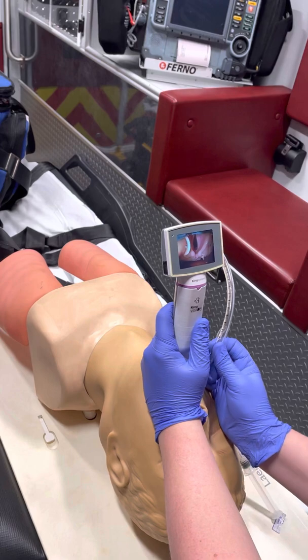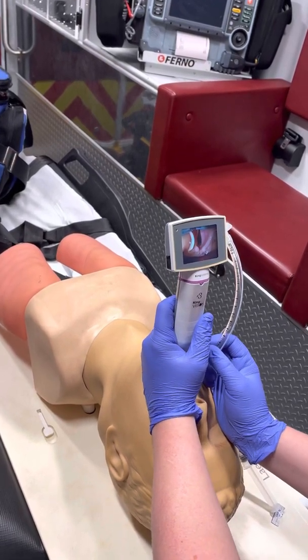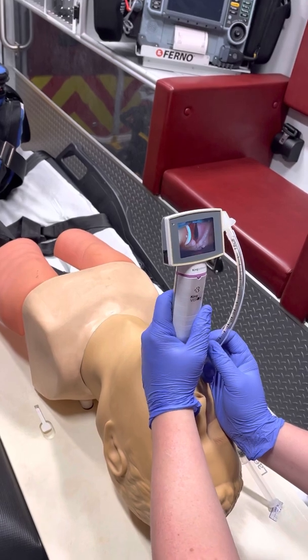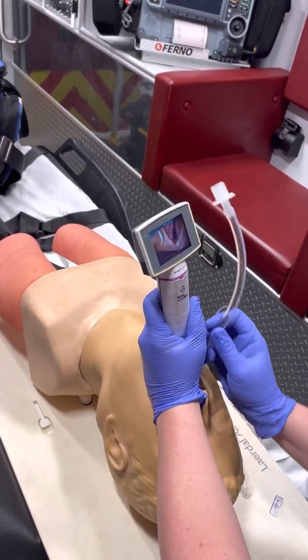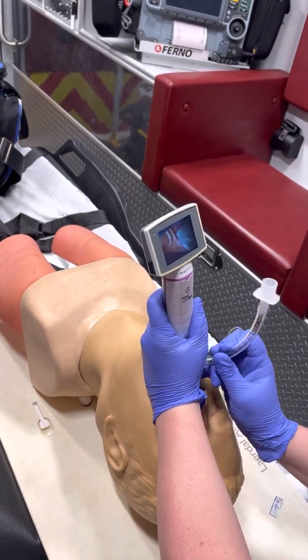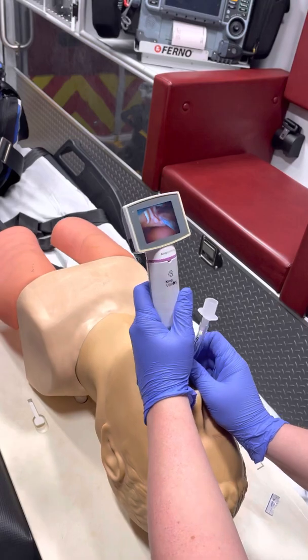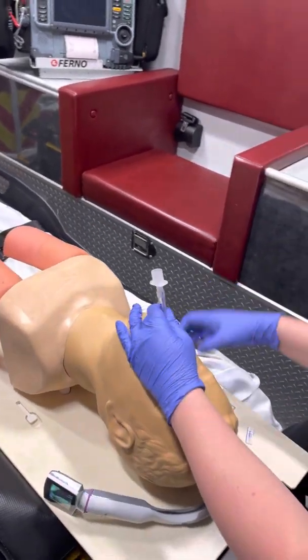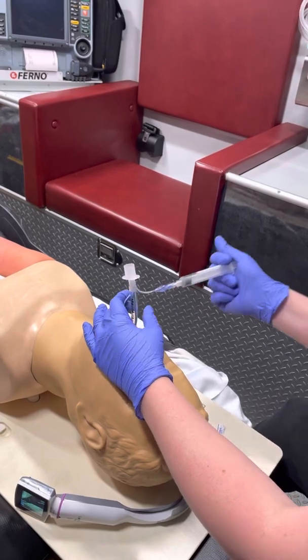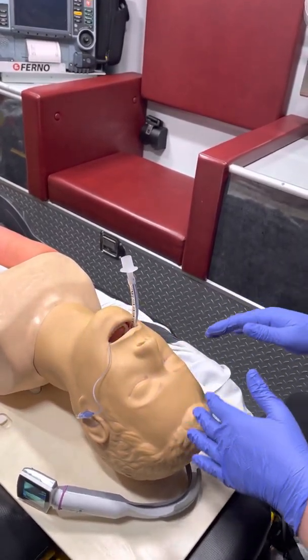There is a quick fix you can do if you get in this position without having to reset. You can use your left hand and turn the scope to the left, and this will allow the tube to pass through the glottic opening. That's a quick fix if you find yourself in that situation, but the most common problem I see with the King Vision is simply inserting the blade too far.